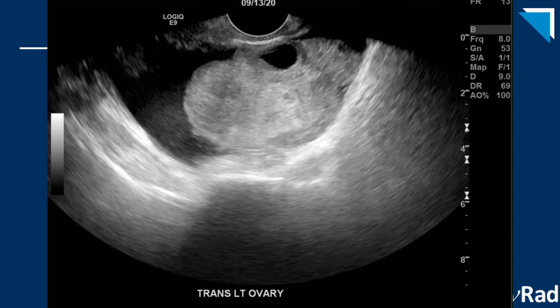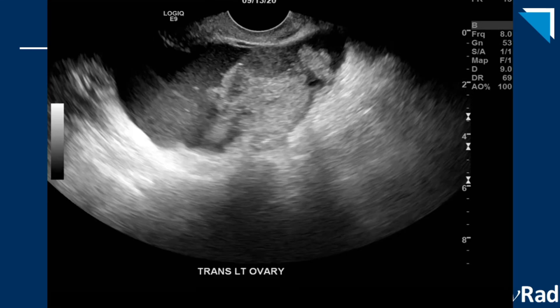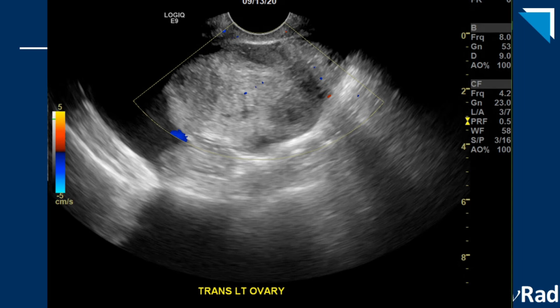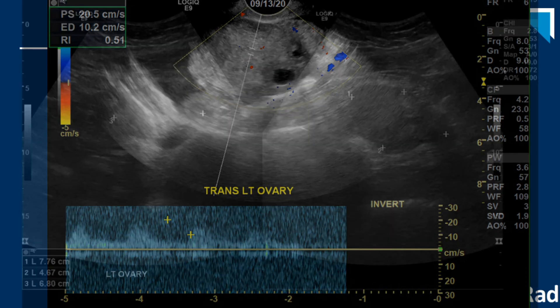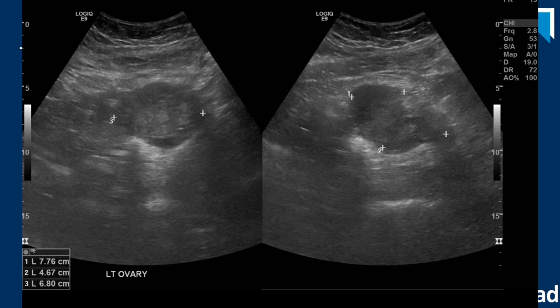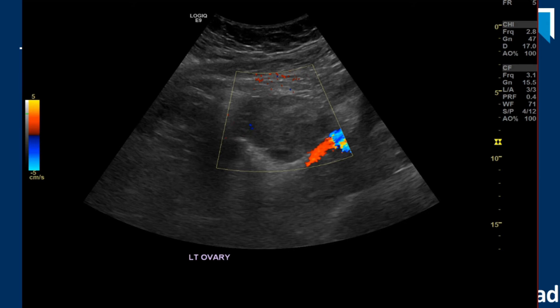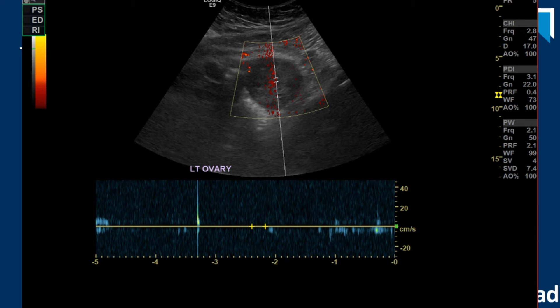Here is an example of a torsed ovary — an echogenic enlarged ovary with a volume of 68 cc, compared to the normal right ovarian volume of 8 cc, with adjacent complex free fluid. The color and spectral Doppler show no internal color flow, though a detected arterial waveform is present. Don't let that throw you off the diagnosis — this is still torsion and still a salvageable ovary. Our next example shows a massively enlarged ovary with a volume of 130 cc. This appearance alone is enough to call torsion regardless of Doppler. The color Doppler shows no internal color flow and the spectral gate cannot find a waveform. This ovary is likely beyond salvage.